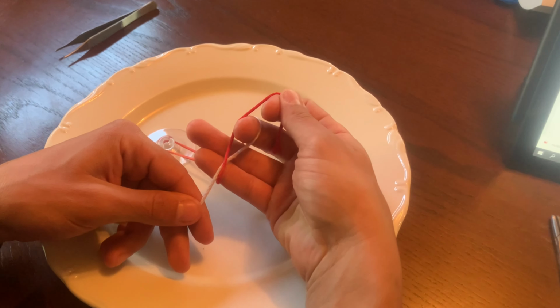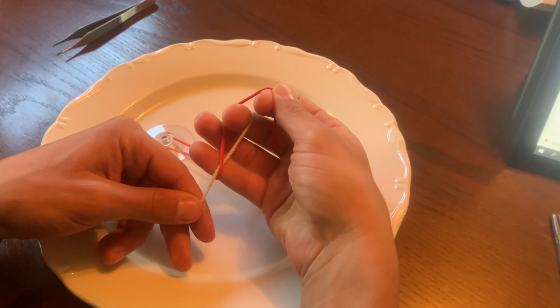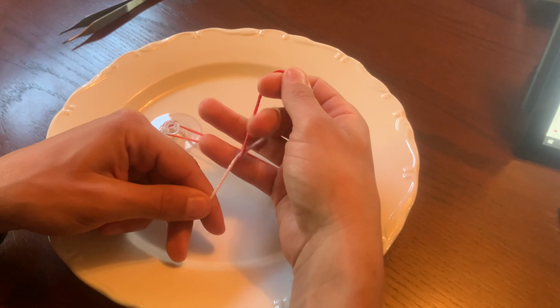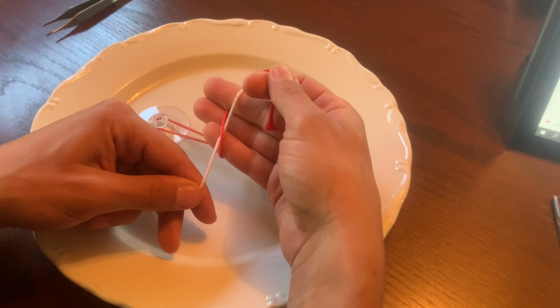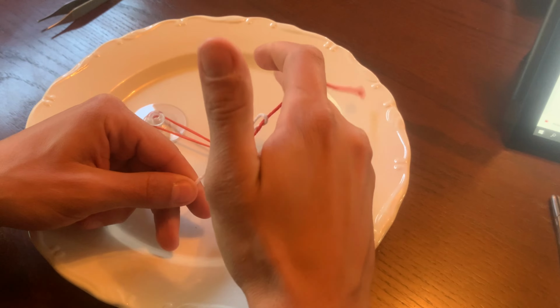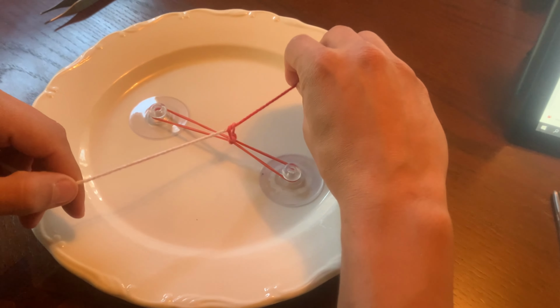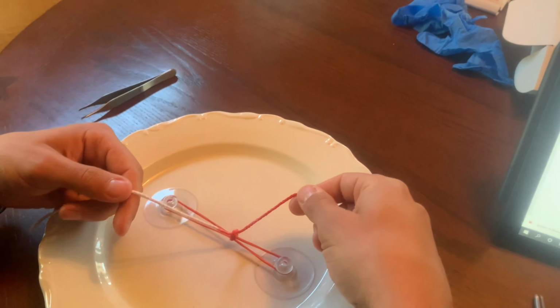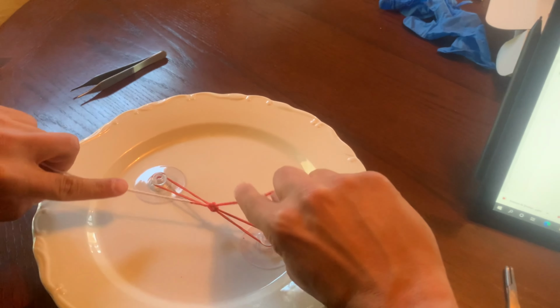So like that, we're gonna hook this outer suture, I should say, right here, and then re-lengthen this middle finger. We're gonna pull it through here and then extend here. Okay, and pull the ends tight, placing tension with the index finger.